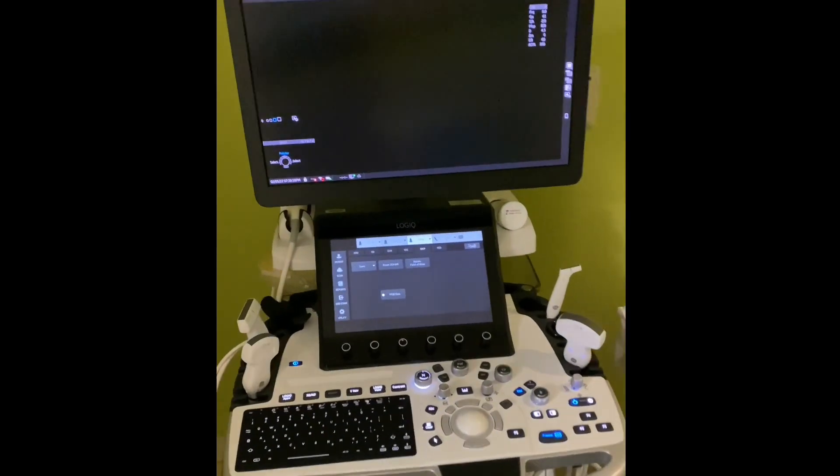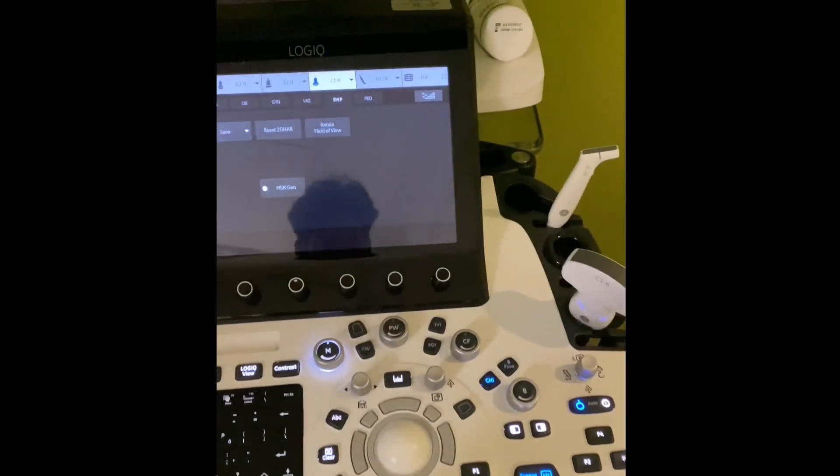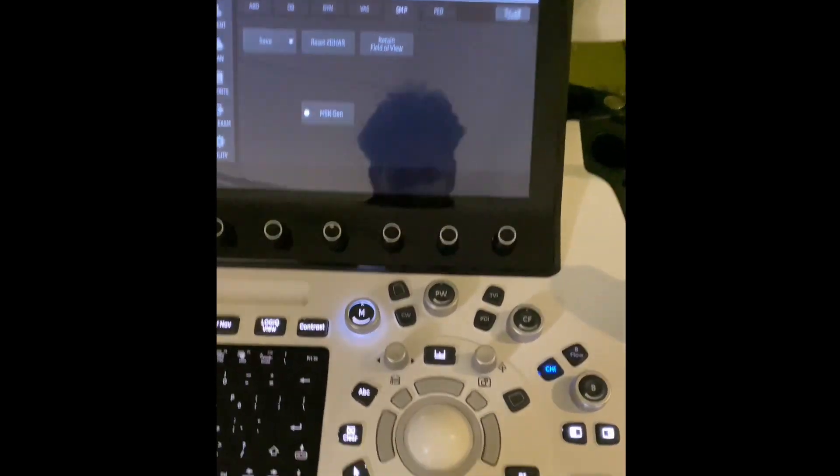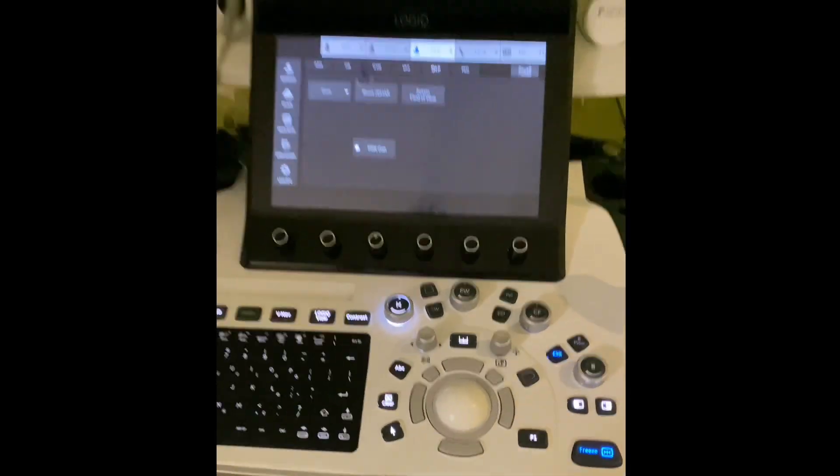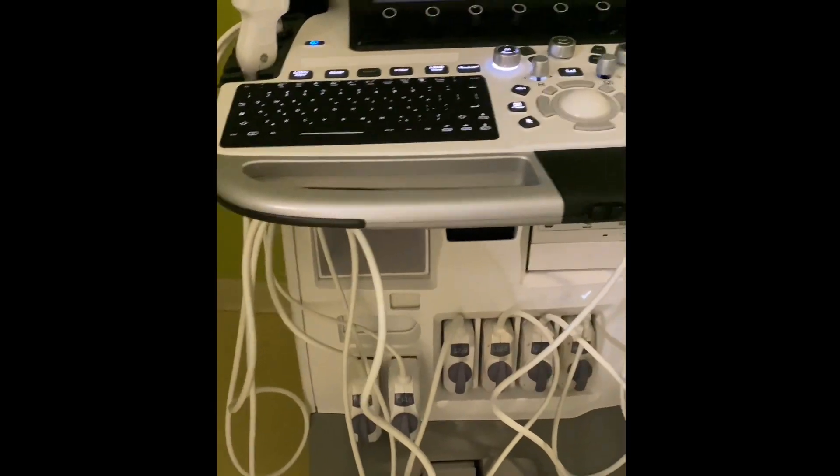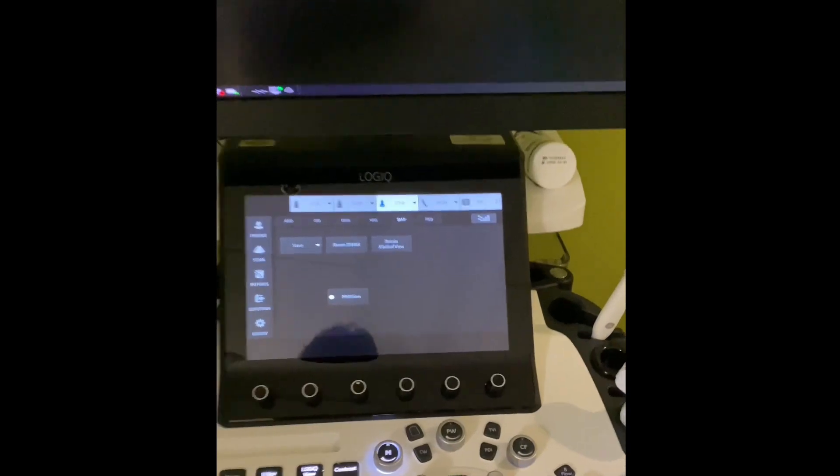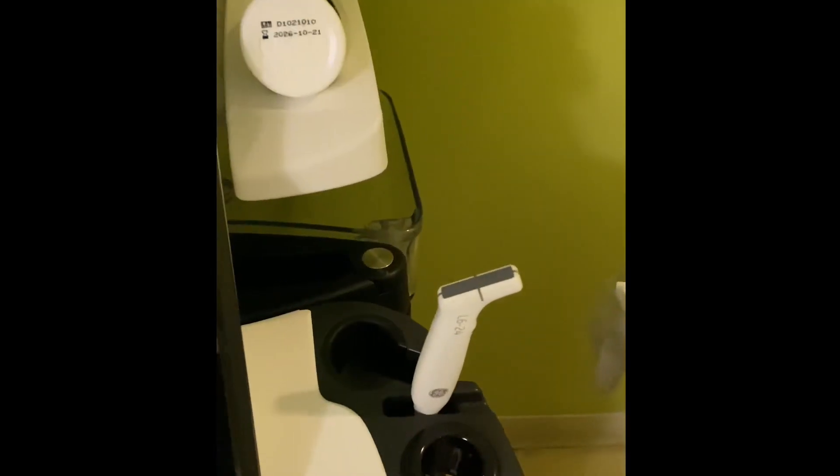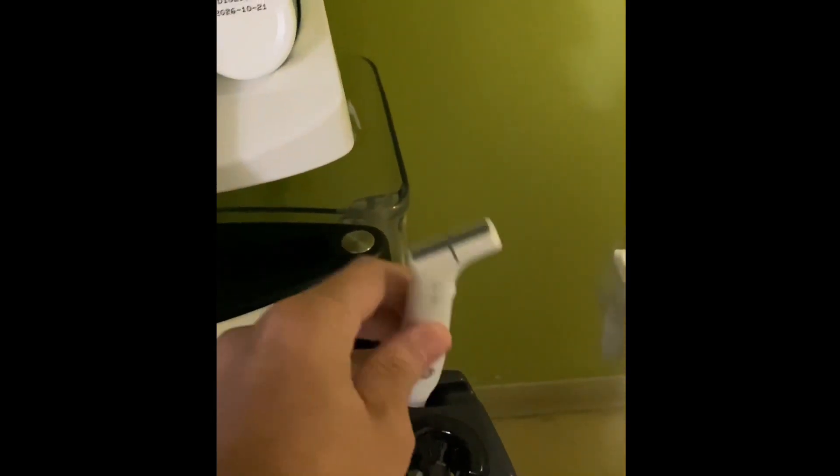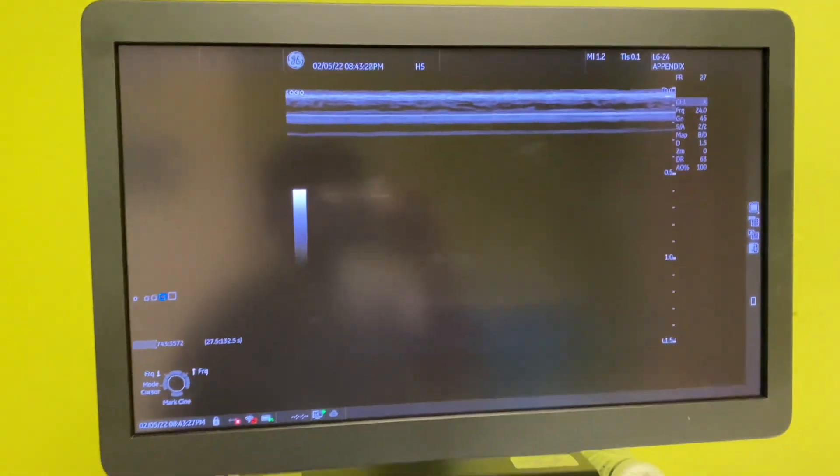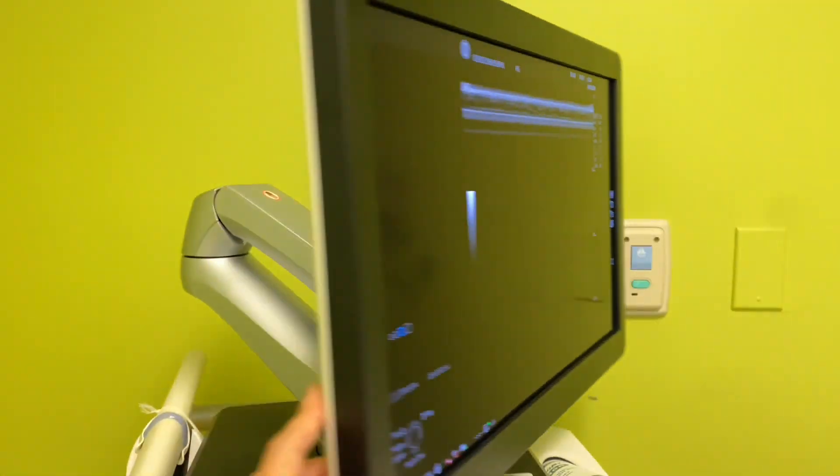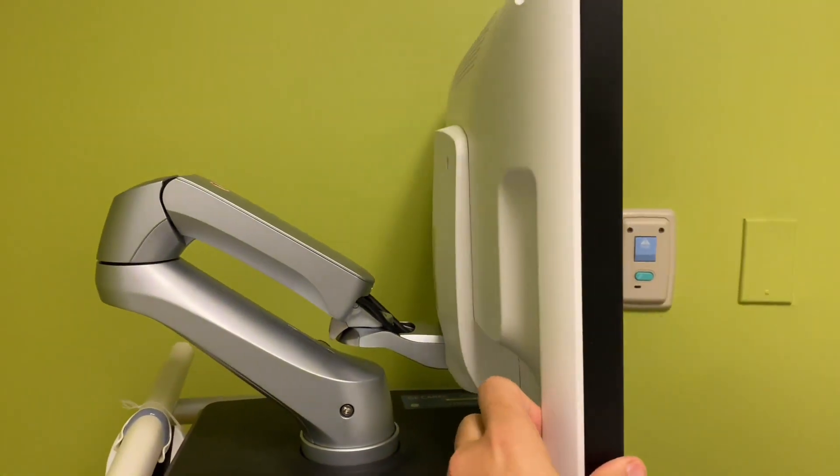Oh, what do we have here? I'm gone for a few days and we get a new machine. GE Logic E10. My word, this thing goes up to 24 megahertz. All right, so here's a quick breakdown of the new machine, GE Logic E10.